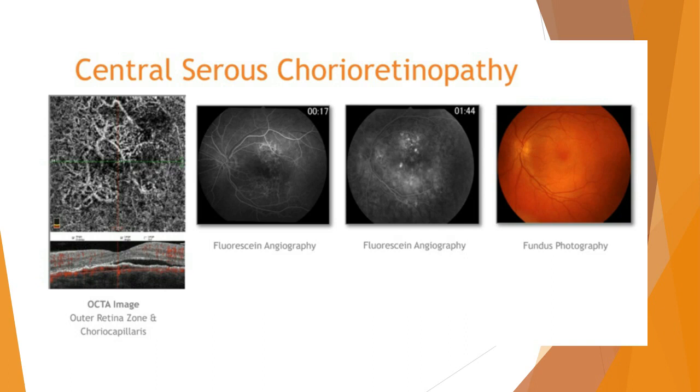There's the neurosensory detachment adjacent to it, and then you can see that there's increased flow within that lesion, or that area of RPE that has shifted anterior. So we're suspecting there that this patient has developed an occult membrane, an area of hyperreflectivity below the RPE.